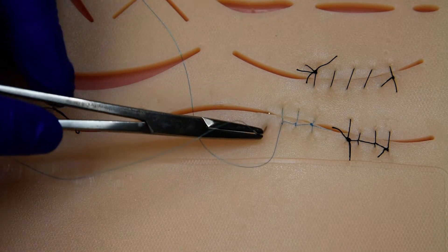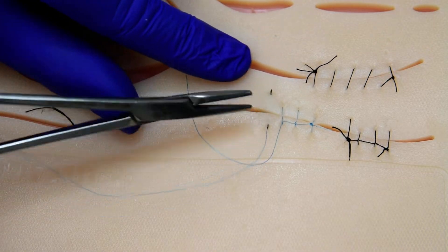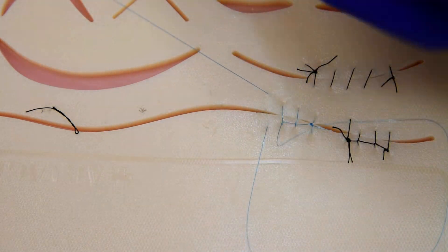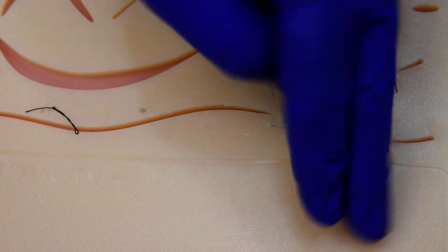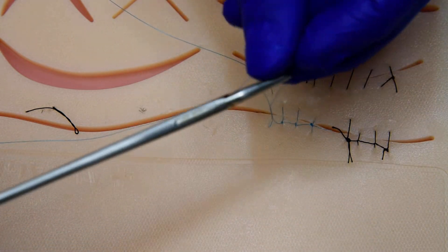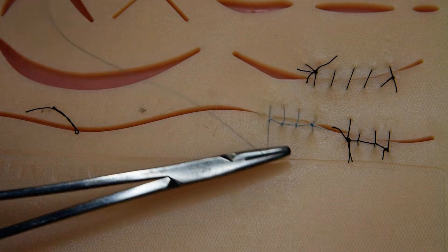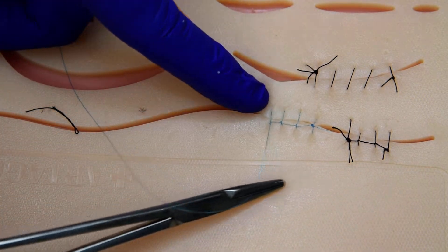We'll do a couple more throws, same thing. Get our loop — once, twice. Pass it through. Tighten it down. Rock it, and lock it into place.